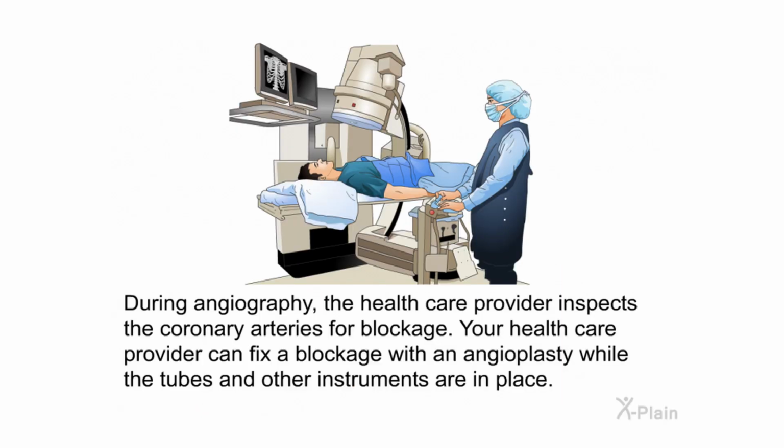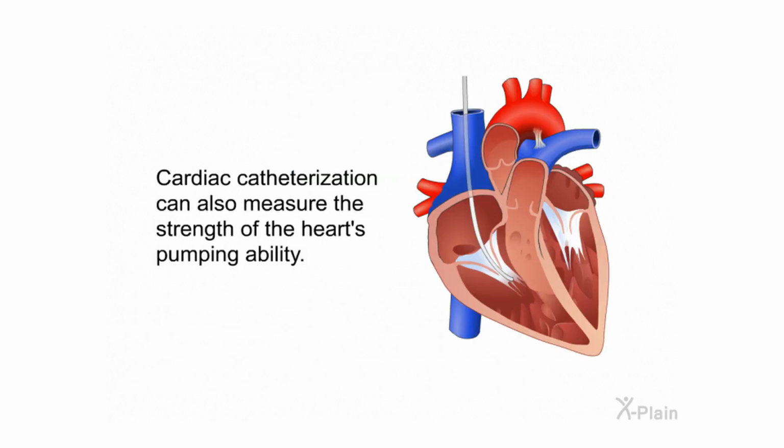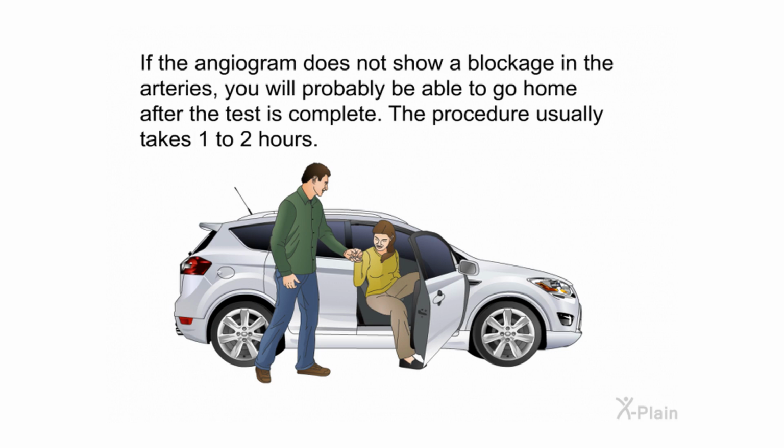During angiography, the healthcare provider inspects the coronary arteries for blockage. Your healthcare provider can fix a blockage with an angioplasty while the tubes and other instruments are in place. Cardiac catheterization can also measure the strength of the heart's pumping ability. If the angiogram does not show a blockage in the arteries, you will probably be able to go home after the test is complete. The procedure usually takes 1 to 2 hours.